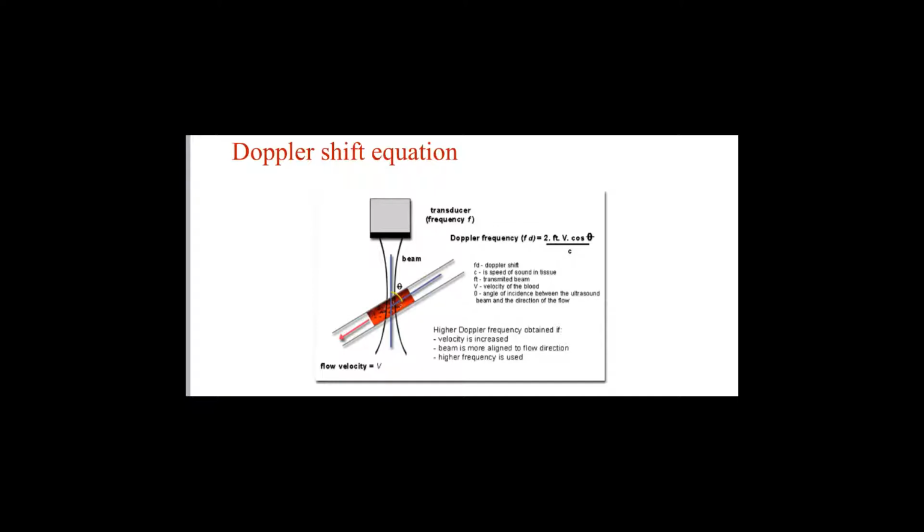image quality. ودي معلومة لازم تكونوا عارفينها صح؟ The frequency is proportional to the image quality, or to the resolution of the image. The higher the frequency, the higher the resolution of the image. With one caveat: the higher the frequency, the lesser the penetration. دي المشكلة اللي بتواجه الهاي frequency. إنه it's good في الimage quality, لكنه unfortunately depth بتاعه is low. It cannot penetrate so far.